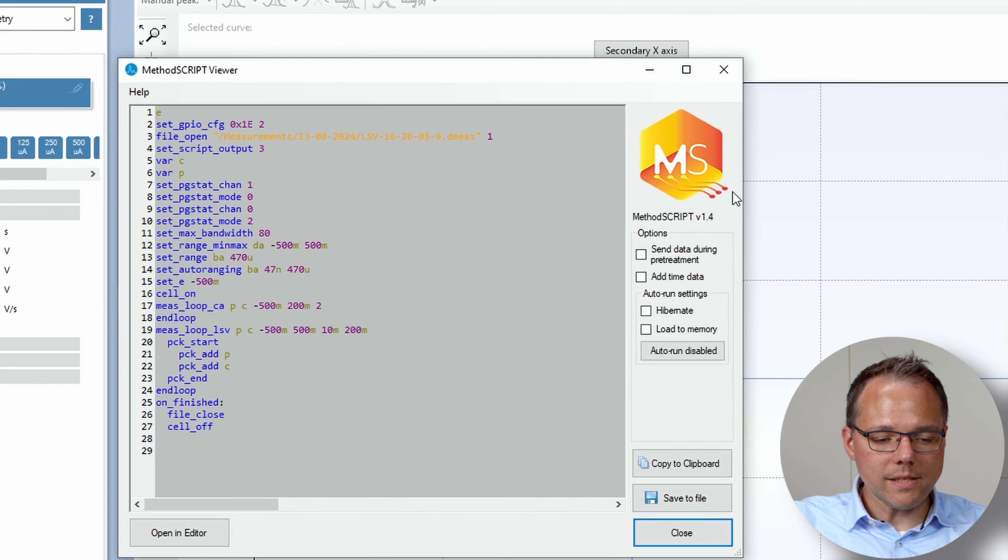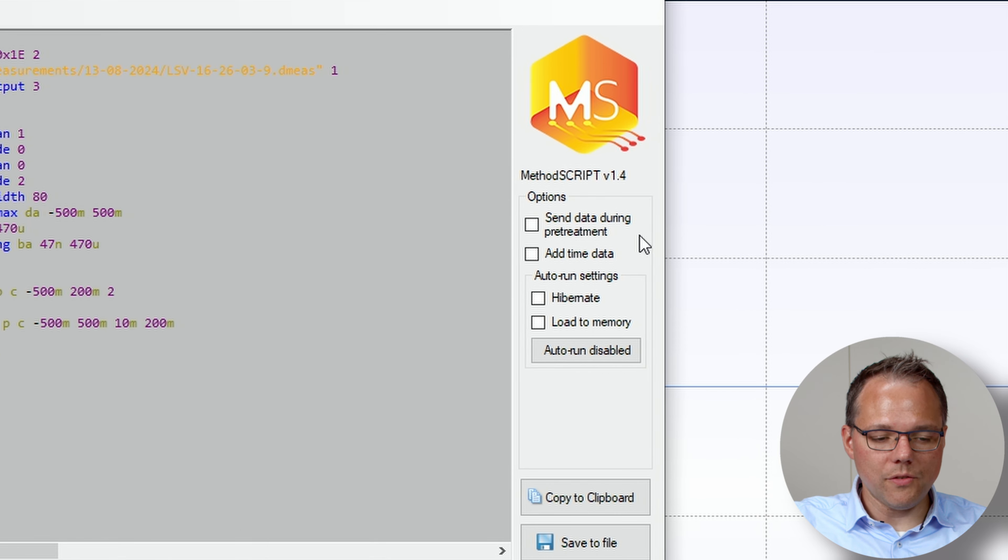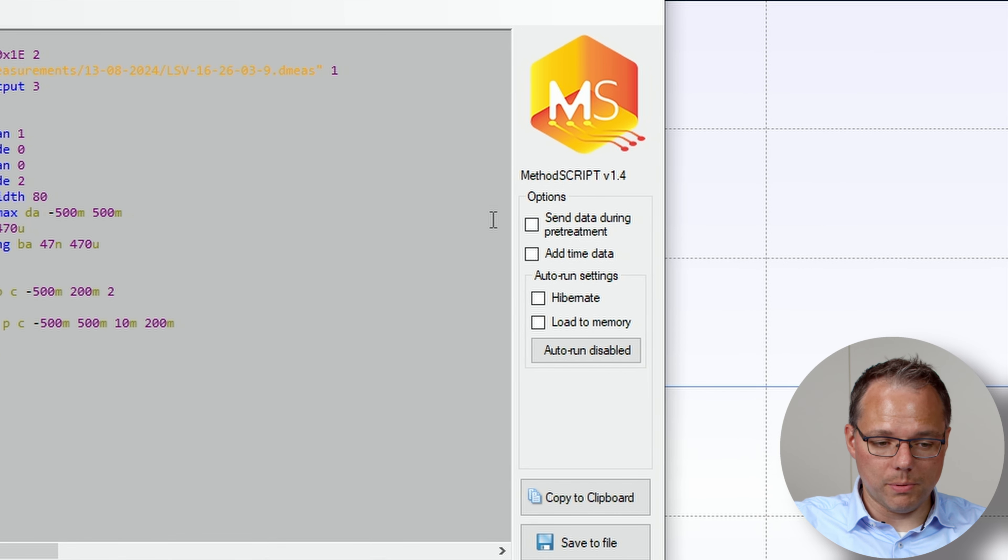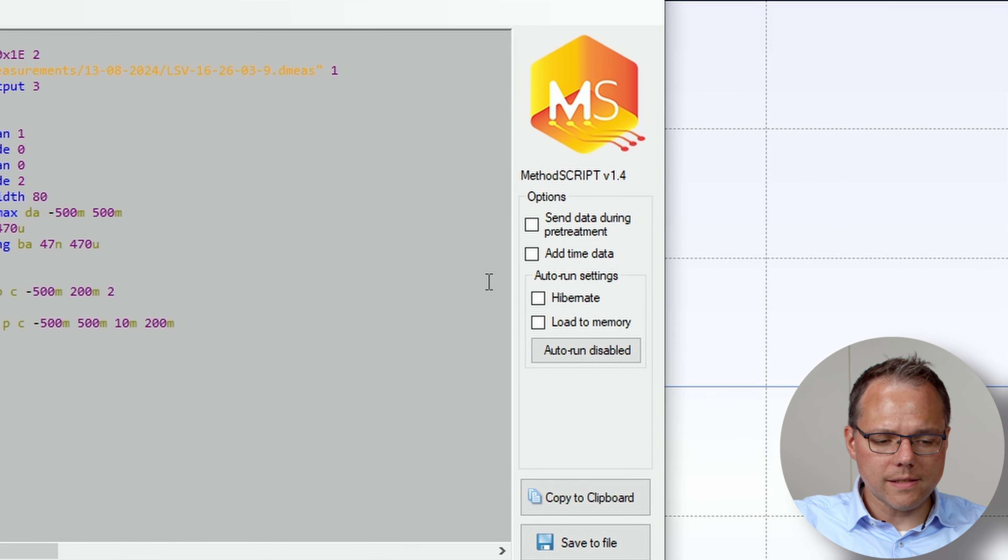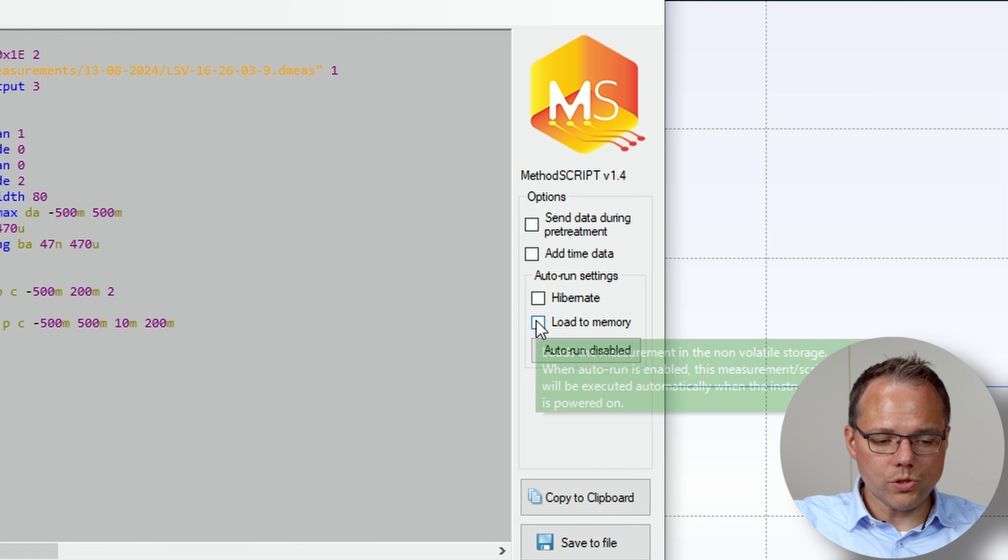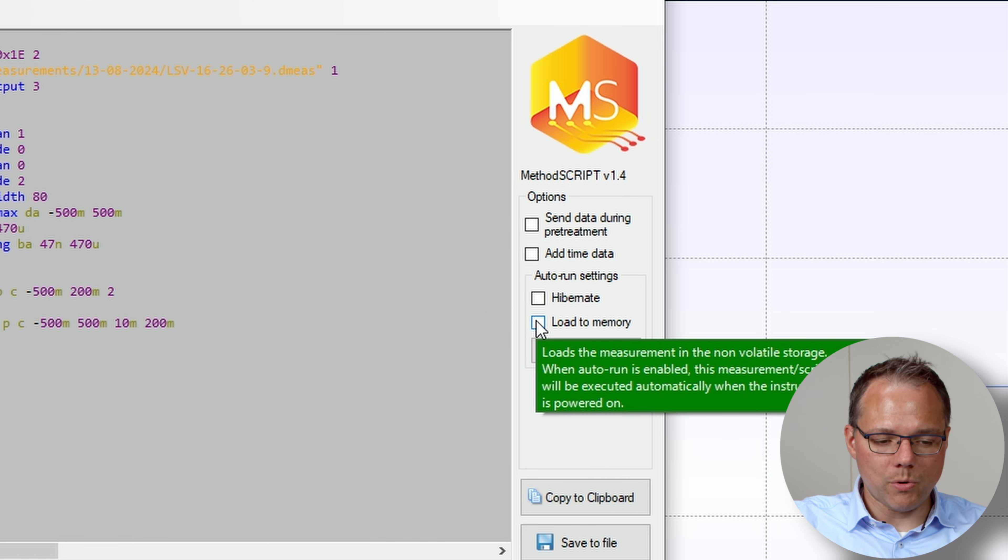Okay on the right side you will see a few options for the Sensit wearable and for us the interesting one is load to memory. With this option you will after a script has been sent to the Sensit wearable save it in its non-volatile memory which just means when it is starting up it will have exactly these parameters already loaded.